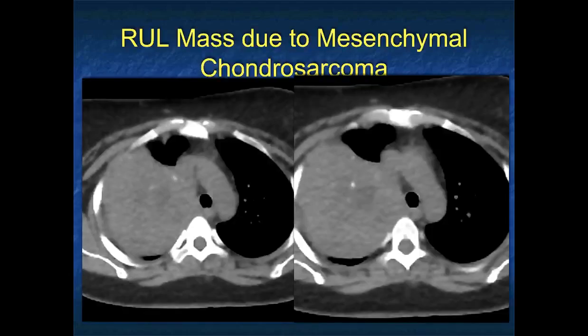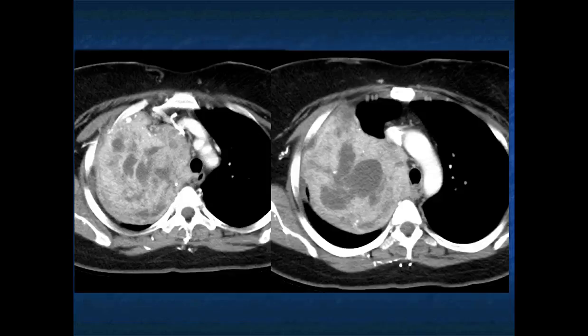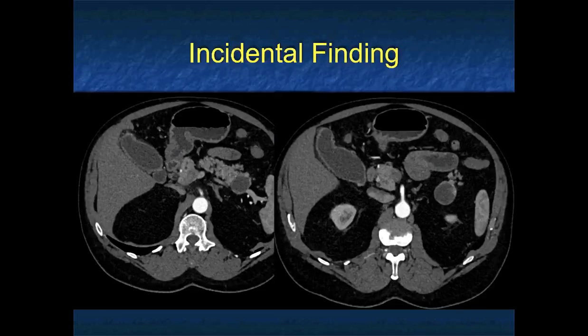This was biopsied, and this was a mesenchymal chondrosarcoma. Very unusual tumor. You can see sometimes chondrosarcomas or osteosarcomas, they arise in the chest wall, can occur more frequently in patients who've been radiated, particularly osteosarcoma, but the patient had none of those histories. This was just a very unusual right upper lobe mediastinal mass. Just a really nice case.